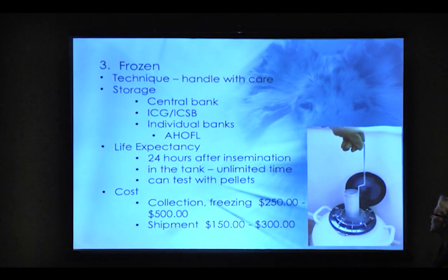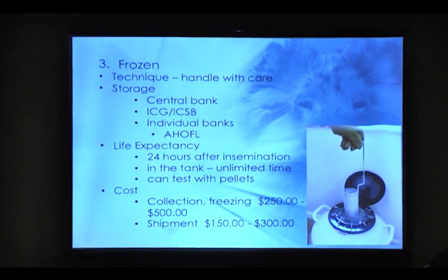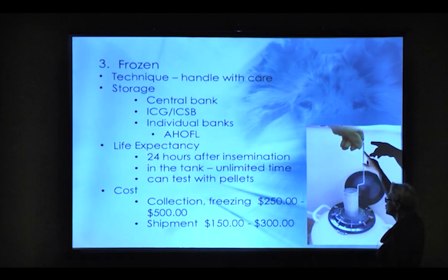Frozen technique: handle with care. Okay, this is liquid nitrogen. We're looking at a new thing called liquid helium that apparently stores better. It's a little harder to handle, but they're using it in Australia to freeze meat, and it works really well because it keeps the continuity of the cells better. So we're thinking about changing over. But you do have to handle it with care. You see there's a glove on this hand, because you can burn your fingers really badly working with it.